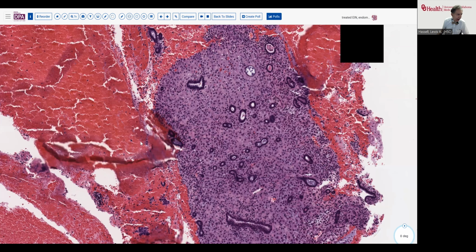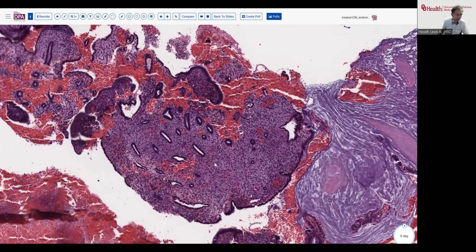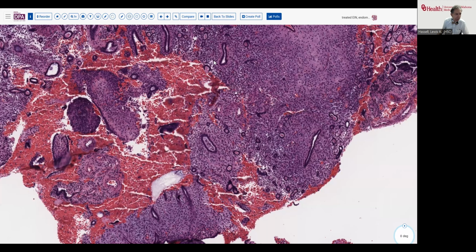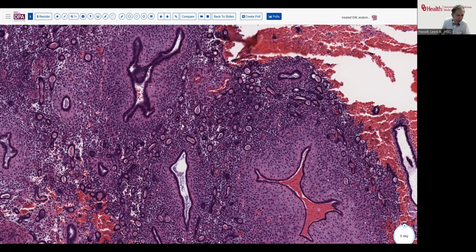Now we'll contrast that to what we might see here, for example. Well, that's mucus. So let's look here. Again, that looks fairly good. These are small shrunken glands. And here you see how very shrunken these glands can become. But notice that these glands are still a little bit close together. So we have this very pronounced decidualization, but we've got these glands that are a little bit more tightly clustered and prominent than we might normally expect. So that's a little bit atypical.